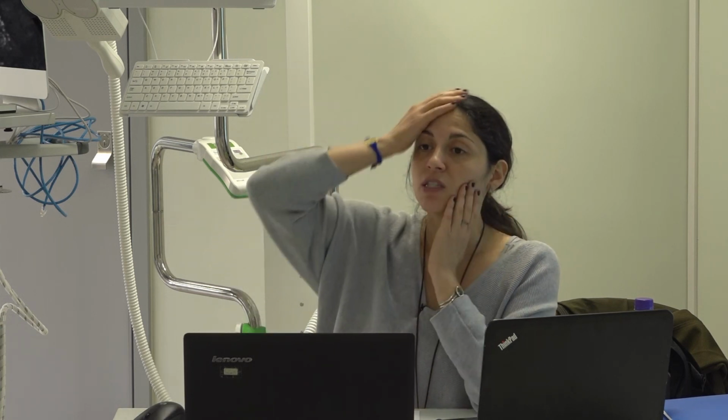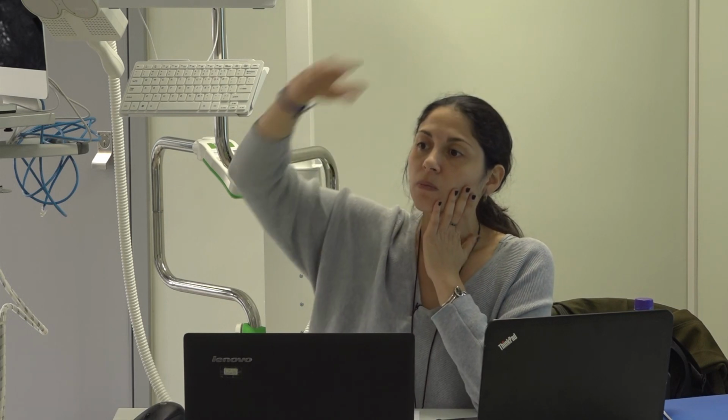Because they are perfect. They are perfect cognitively. If you compare one, which I did, healthy with the participant, there are no differences between them behaviorally. Psychologically, it's different. They think they are different because they know they have MS, but in the tests and all the tasks, I never told them they were performing badly. In the end, I did tell them, because they said, no, but I know I'm not that good because I have MS. No, they were normal. So we stimulated the dorsolateral prefrontal cortex to try to impair their working memory. Did it happen? No, it didn't.